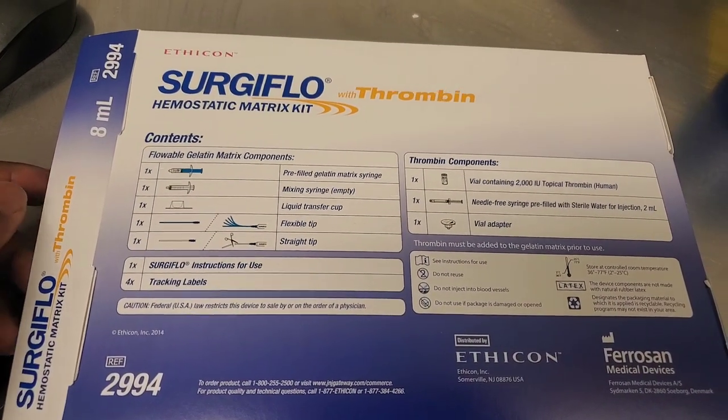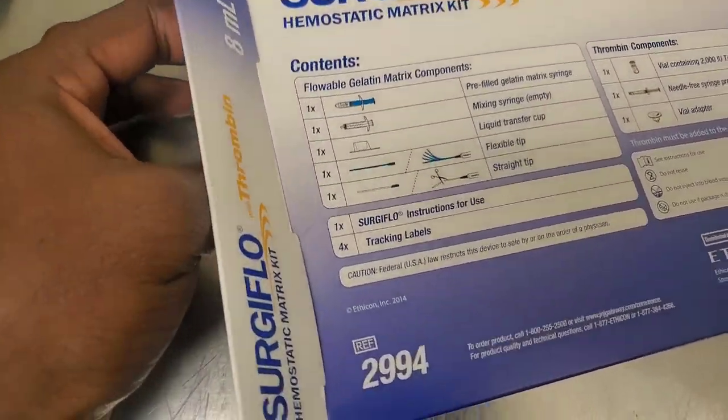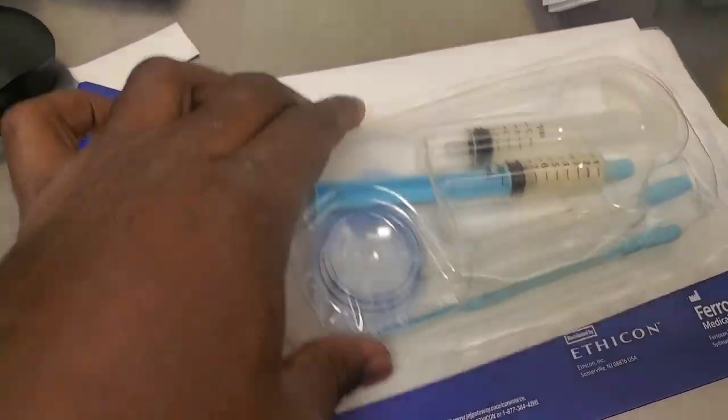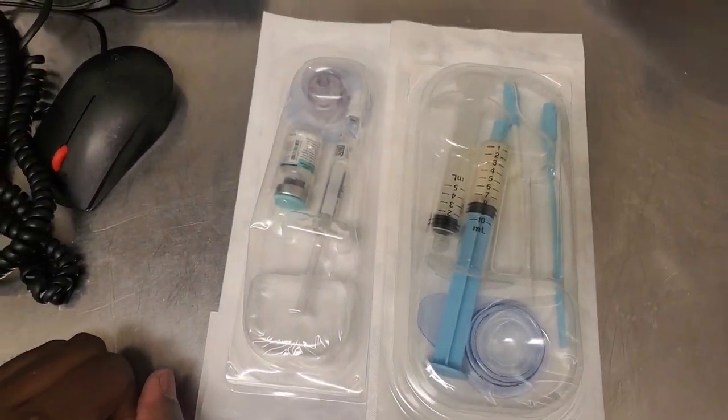Okay guys, so we're just going to go ahead and open up this box. It comes in two pieces in the box — this first piece and this second piece. So pretty much these are the two pieces that come in it.